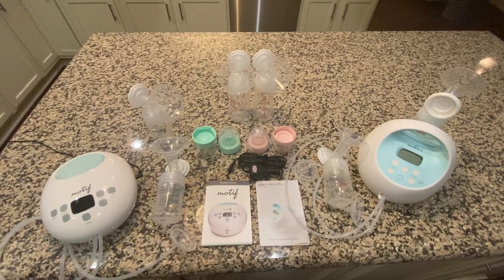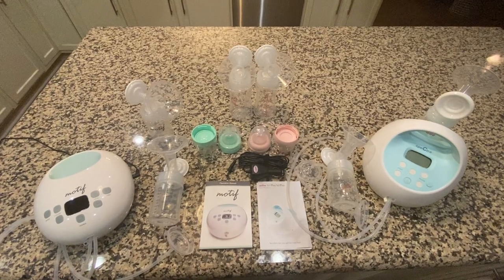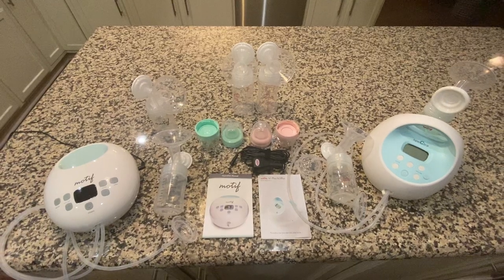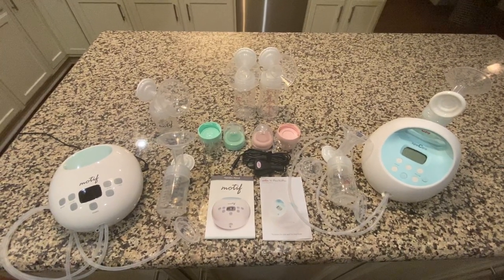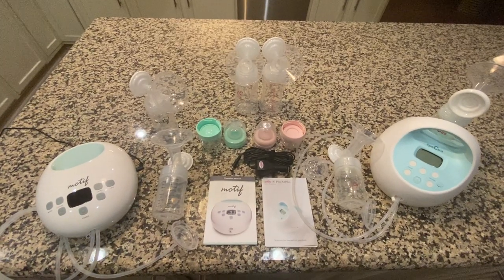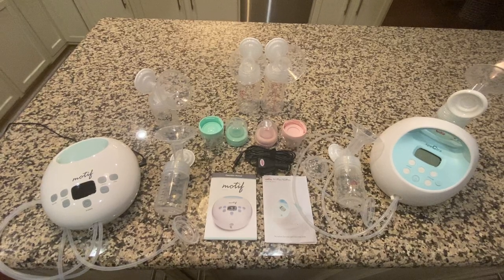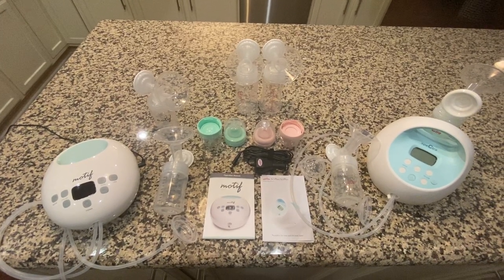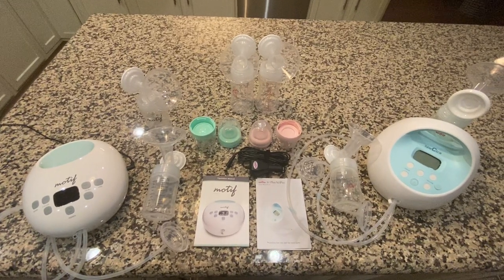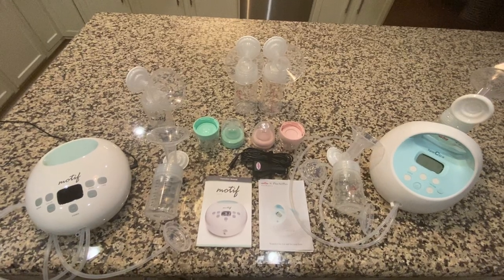Hi ladies, today I'm going to do a review of the Motif Luna and the Spectra S1 breast pump. I wanted to talk about my experience with breastfeeding. I had my first son seven years ago, and my breastfeeding journey did not go as planned. I was using the Medela Pump and Style Advance — it's a great pump. I wanted to try some different pumps on the market this time, which is the only reason I didn't get another Medela.